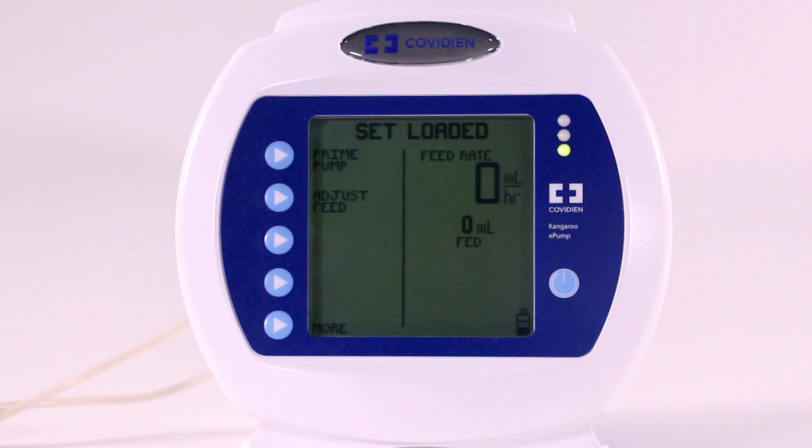Programming your pump for Continuous Mode is simple. The ATM-style interface uses on-screen prompts and arrow screens to set the speed of delivery and, if desired, the total volume to be delivered, or VTBD.